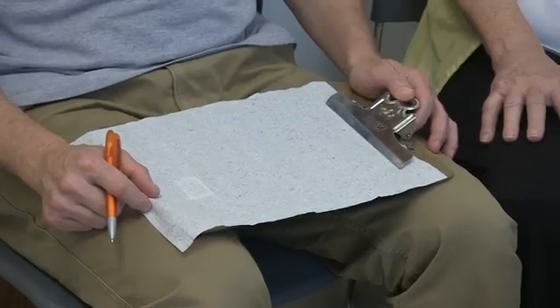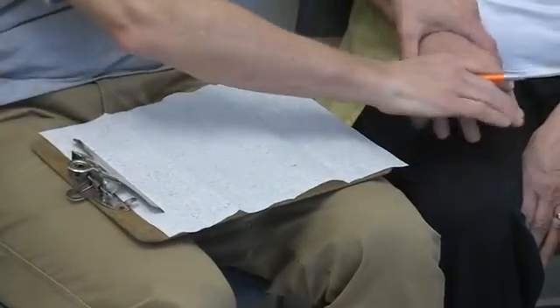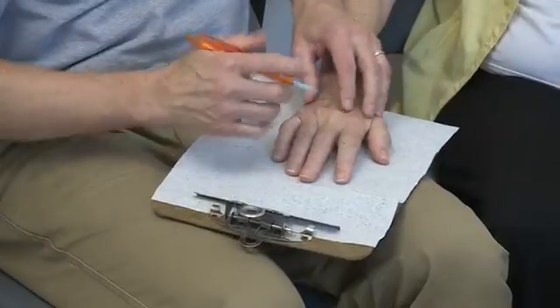The first step is to make a splint pattern. So we're going to move this hand over and make our splint pattern.